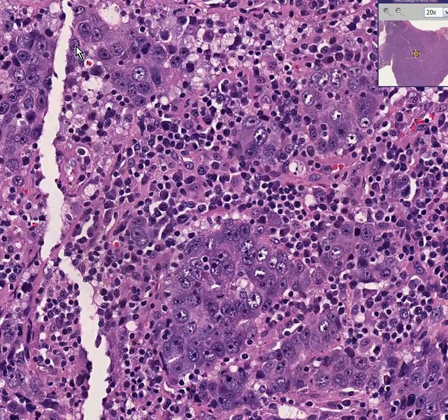This is a medullary carcinoma, and it's often in younger women, and it also has a generally more favorable prognosis because it has so many lymphocytes surrounding it. You would think, gee, the body must be fighting this tumor tremendously with all these lymphocytes, so maybe she'll do better than normal. Or perhaps you want to go back to what your eyes saw grossly, in that it seemed to be very well delineated and not infiltrating too much. But statistically, these do better than the run-of-the-mill infiltrating ductals, just like the colloid carcinomas do better as well.